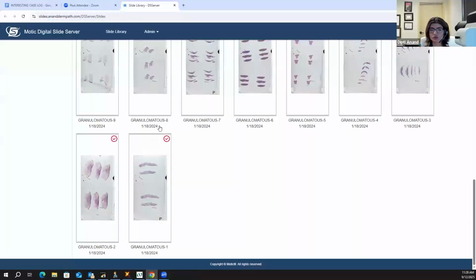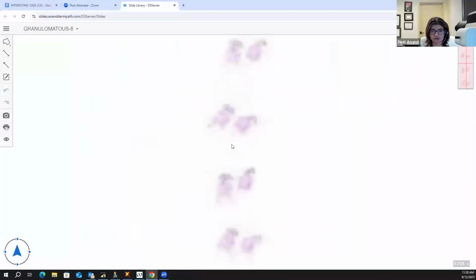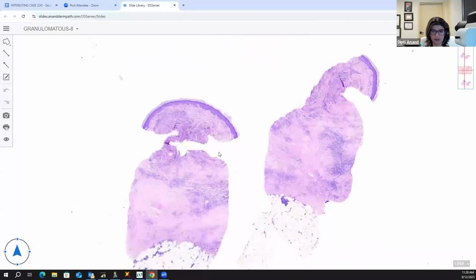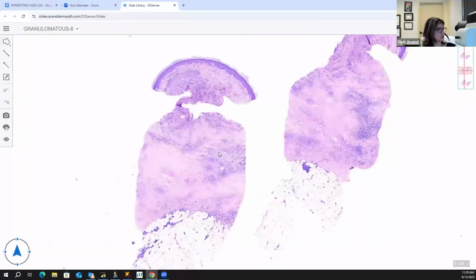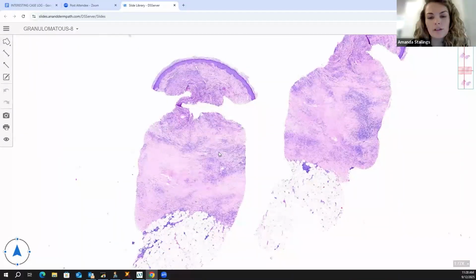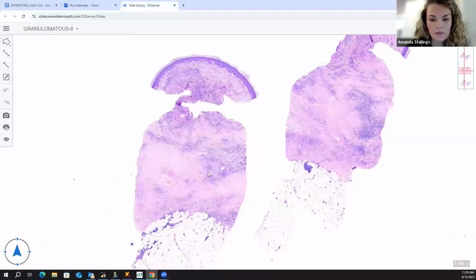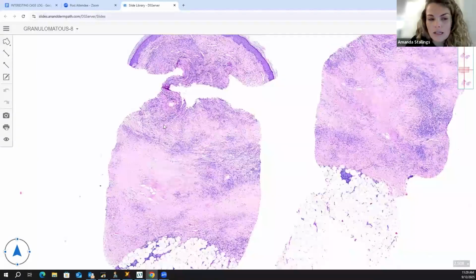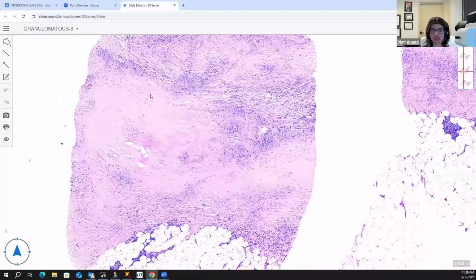Slide 7, and then we have the next one, which is the 8th. There we have kind of the layers of a cake. It's involving the entire width and depth of the biopsy, and it's the sclerotic collagen, so NLD. Yeah, so this is NLD.